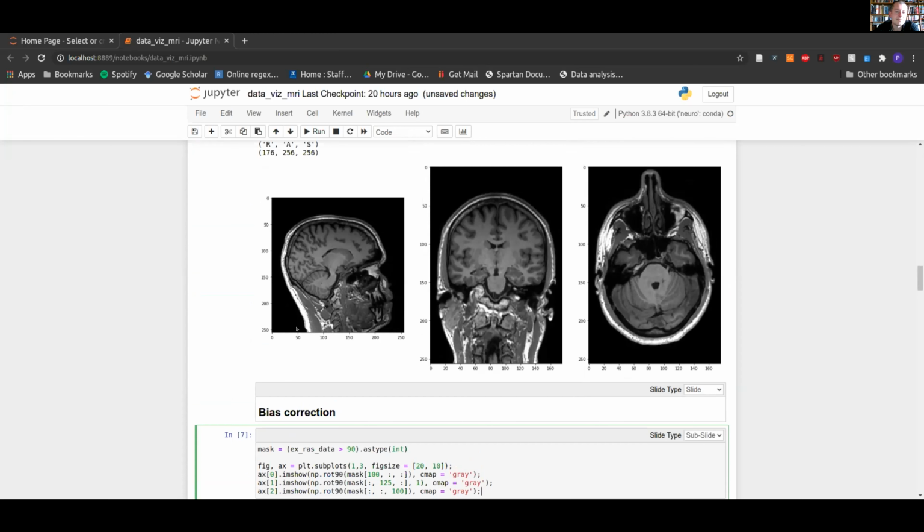The first thing that we notice about these images, though, is there's a lot of black. This black is pretty much just indicating zeros in our data. For those of you who are used to dealing with this sort of information, we could take our matrix and make it into a sparse matrix, ignoring everything that is zero. Except what you can't see is that it's not exactly zero. There's a whole bunch of noise in this image. The black ranges from about 0 to about 90 in terms of intensity.